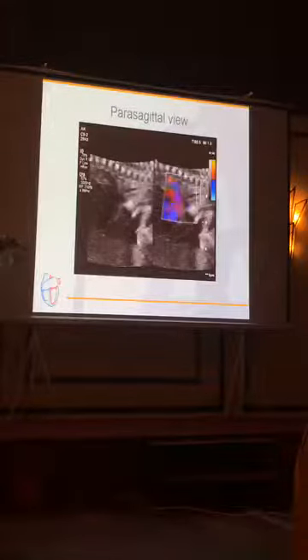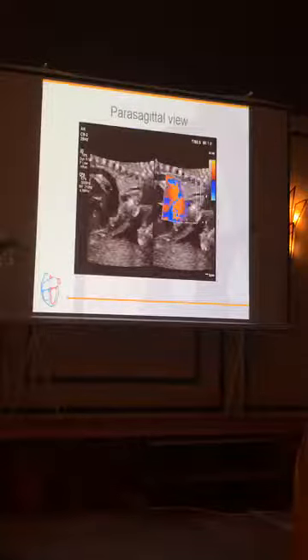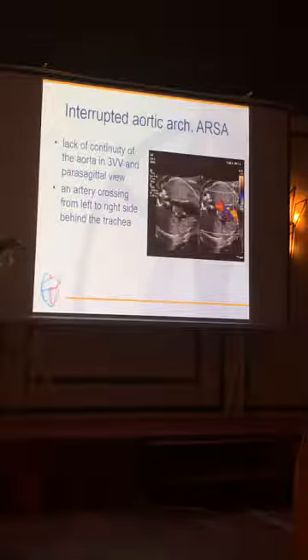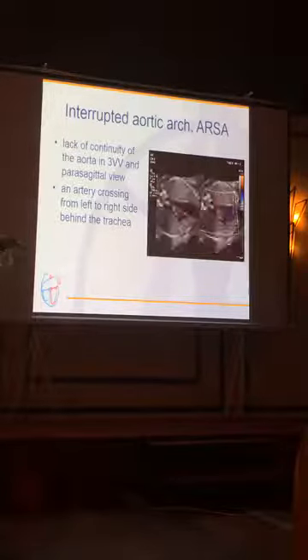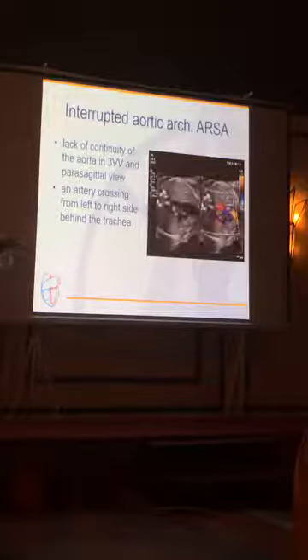So, as you are mostly obstetricians, the one feature we are looking at in cases like this is the presence or absence of the thymus. And look how close the vessels are to the anterior chest wall. So the thymus could be hypoplastic in this case.